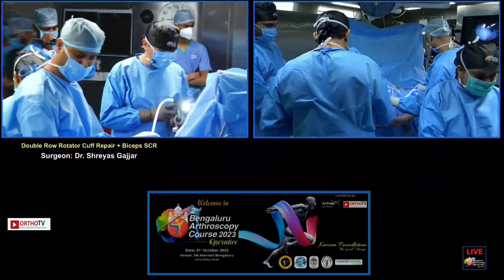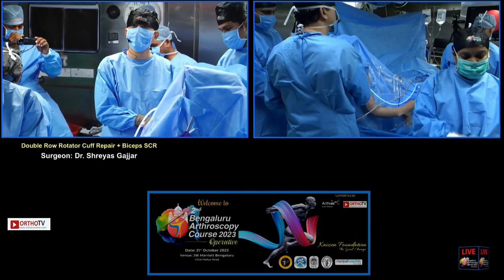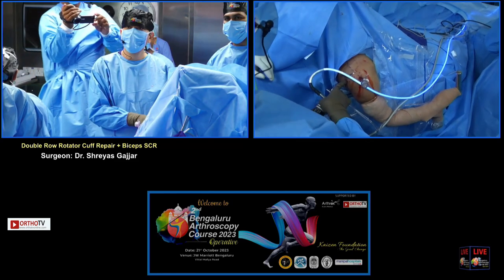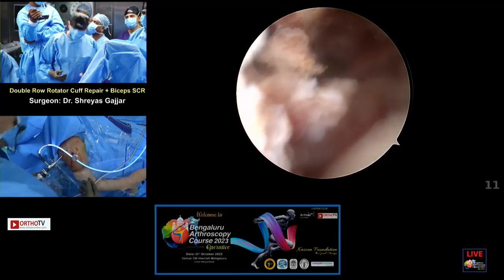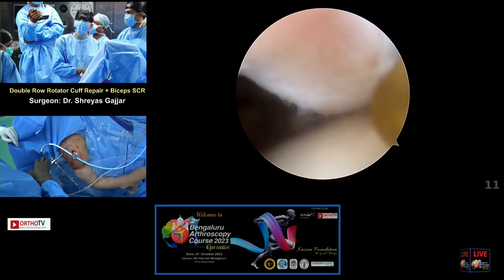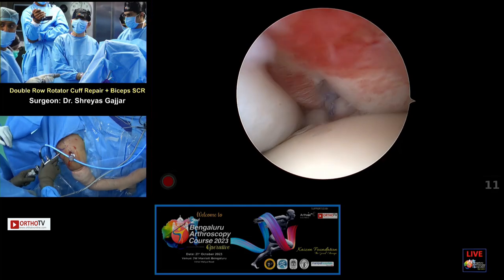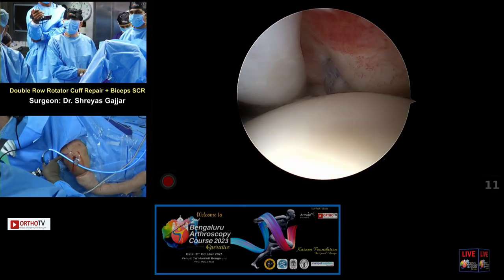So, what was the question on the biceps? Since you did a partial repair of the subscap also, and the cuff supraspinatus is also the anterior portion, shaver, please, both are close to the biceps tendon. So do you expect any tendinitis post-op? No. See, let me finish. There's good vision, so I don't need the shaver. See, this is my repair. Can you see the area?